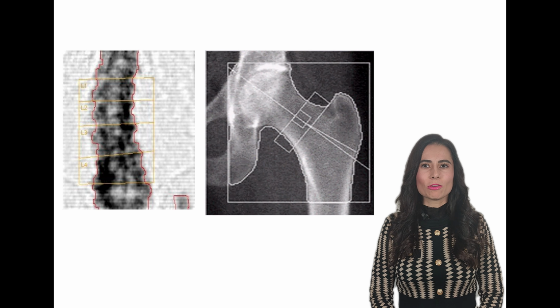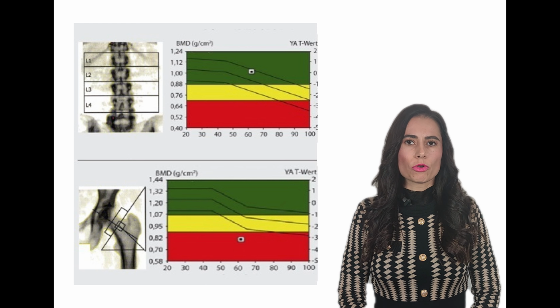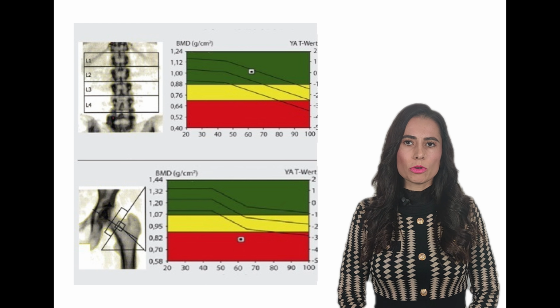Now that I've defined these concepts regarding osteodensitometry, we can ask the question: is the device accurate and precise if it shows normal bone density for your spine but osteoporosis for your hip? In such a situation, there is a significant difference in the T-score between the spine and the hip. But what does it mean for the difference in T-scores to be significant?